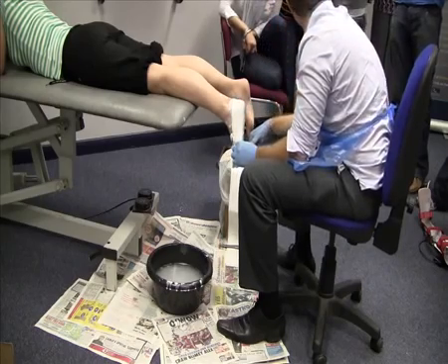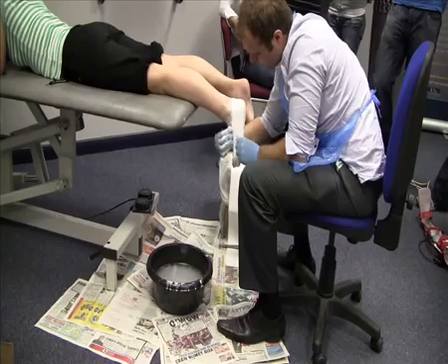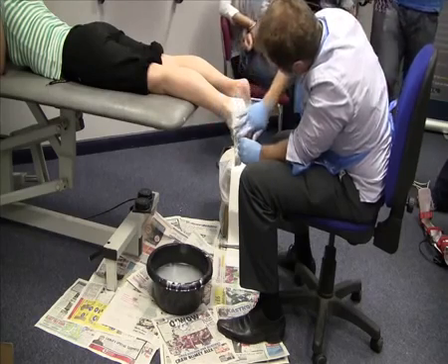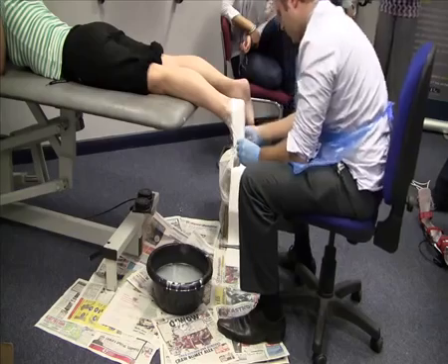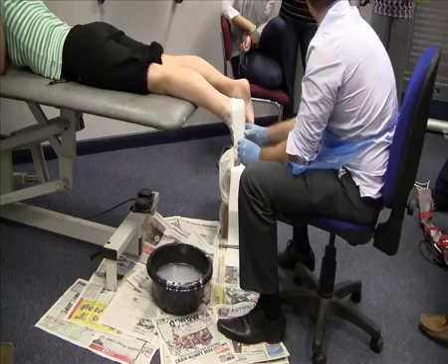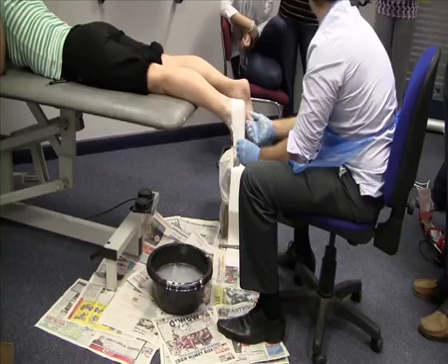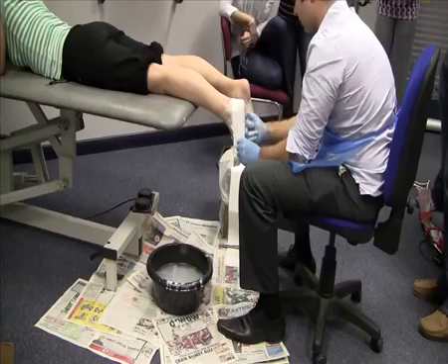Now, depending upon the temperature of the water, will depend on how long I have to sit here for. At this point, I'm just going to make sure that all my edges are together, so that when I come to remove the cast, there's not a problem. Now, you need to make sure that you don't evert or invert the foot, that you're just dorsiflexing. You can plantarflex the first ray if you want to put it in that position, which other people use for windlass casting. It gives you a higher arch profile.